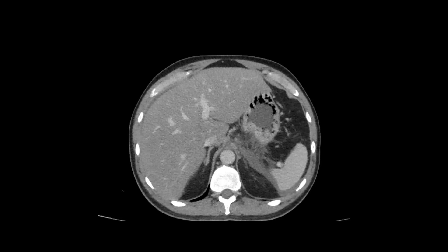This is a contrast-enhanced CT of the upper abdomen. We're looking at the liver here, and it's hypodense, indicating hepatic steatosis. There's also some trace perihepatic ascites, but there's more pronounced fluid along the left interfascial plane tracking about the spleen.